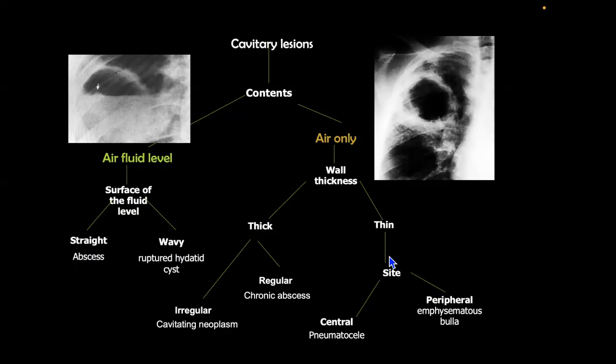The window, it's very important, as the doctor said. Gas usually hinders ultrasound. When the ultrasound waves go through the gas, they just come back. They don't penetrate the gas, and that's why you don't have any picture behind the gas. So when we do the chest ultrasound, we usually have selection criteria for our patients. We prefer to do it on peripheral lesions rather than central ones.